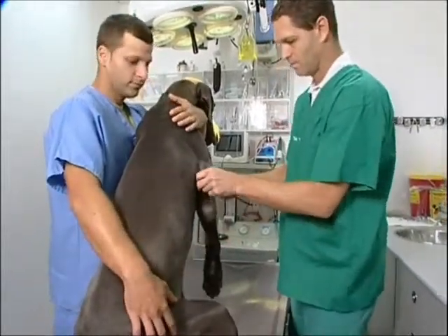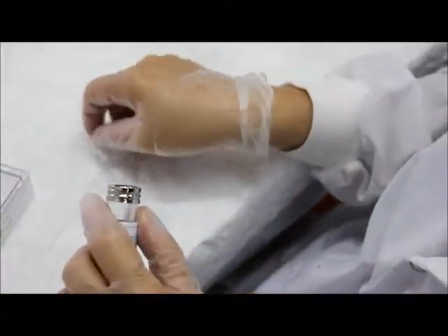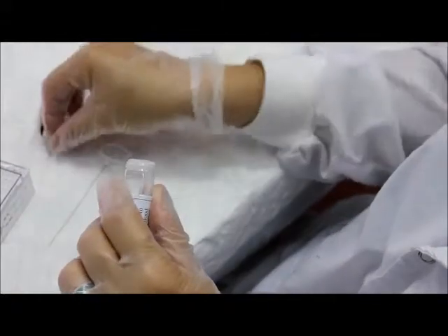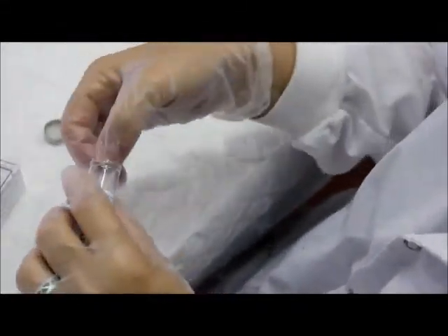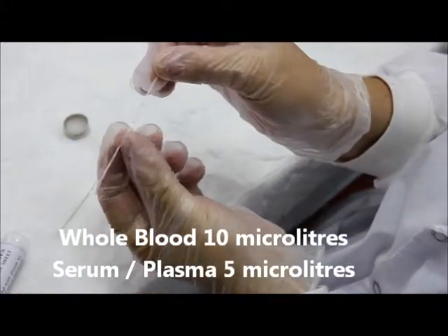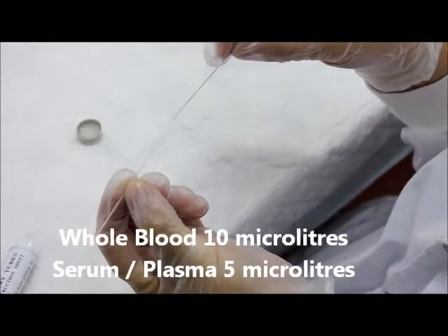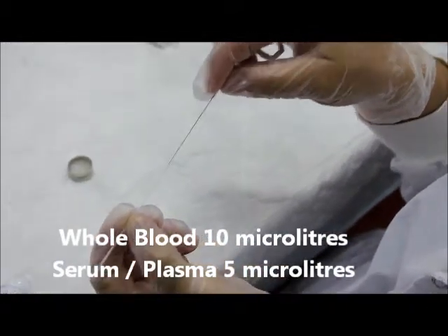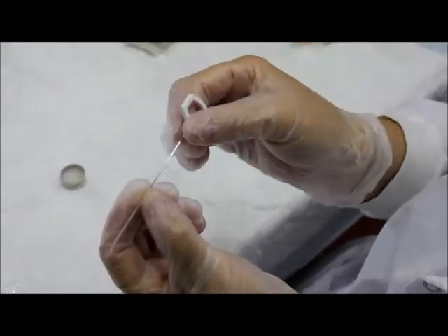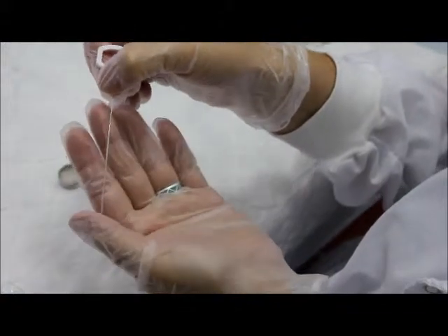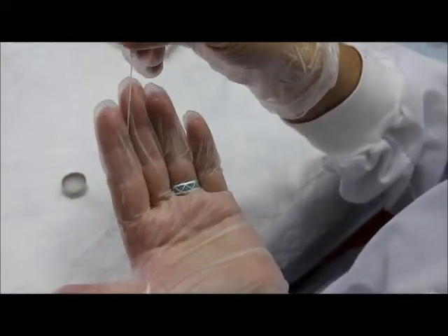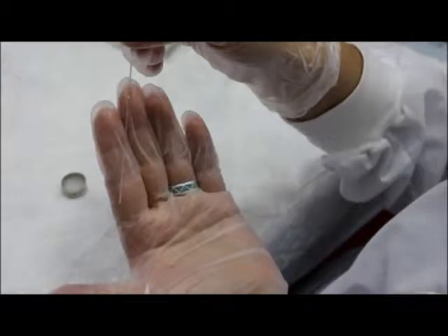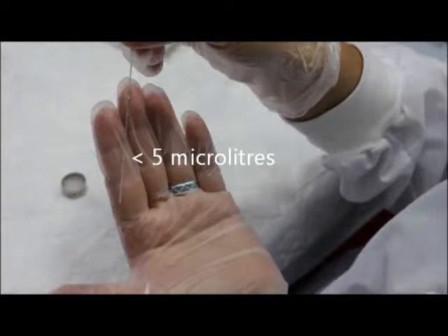Take a sample of blood from your pet being tested. Use a pipette or capillary tube to draw blood or serum from your test sample. For testing whole blood, use 10 microliters. For testing serum or plasma, use 5 microliters. If you are using the capillary tubes contained in the kit, there are two markings: the lower fine line if using serum, and the higher fine line if using whole blood.